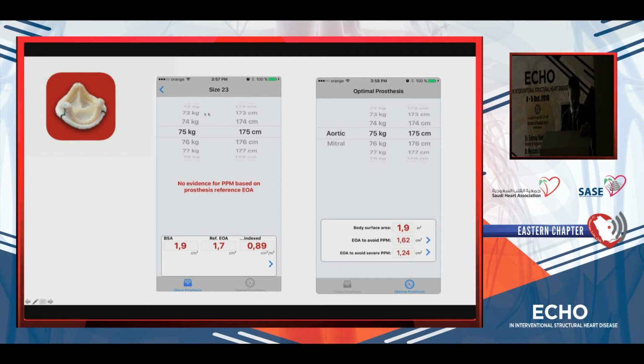And if we put in the valve and the weight and the height of the patient, it can tell you if there is a PPM, yes or no. But also, and I cannot show you on the slides, you can also put in all the measurements that we just got from our echo study, and it can help you through this flow chart.